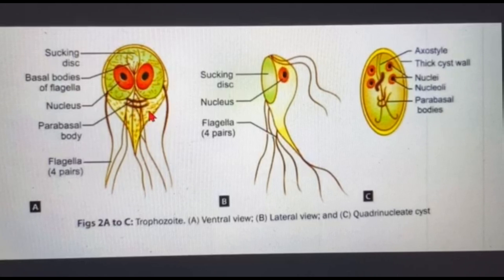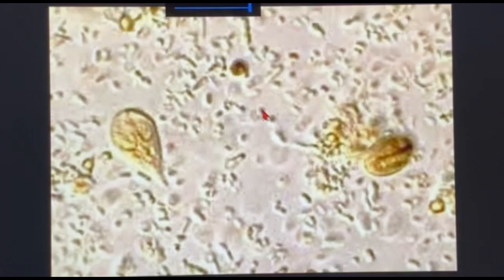So coming back to the slide now. This slide picture was taken in my second year of residency. I am sorry for the resolution but I wanted to show you an actual site and I had taken this picture, because it was showing the trophozoite form and the cyst form in the same field. So if you can see the racket type that I had described or the heart-shaped body, you can see here in the trophozoite.